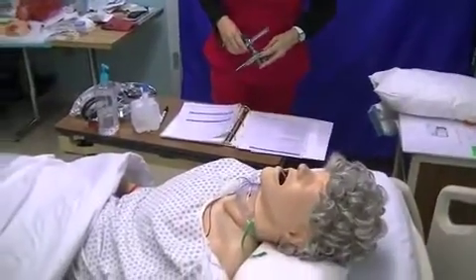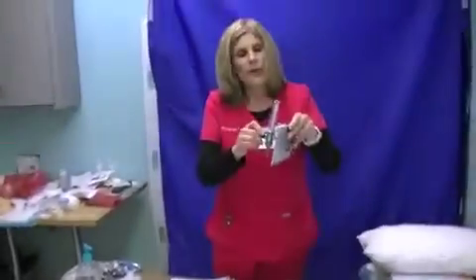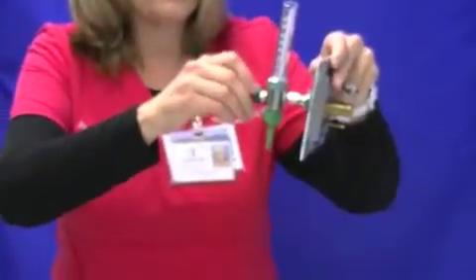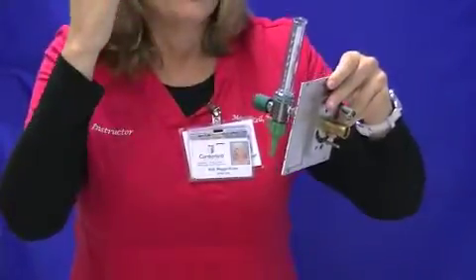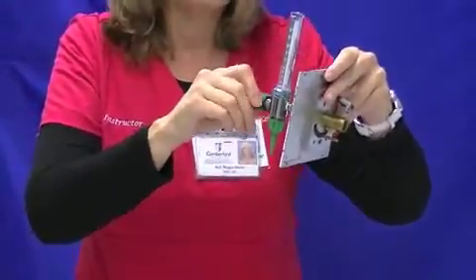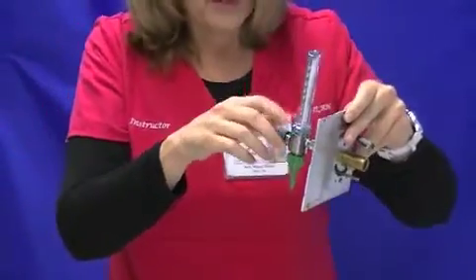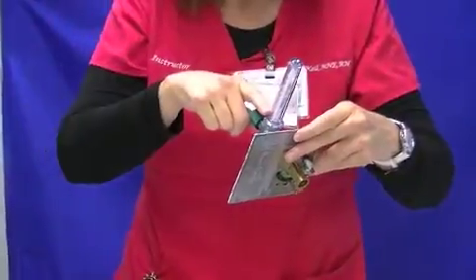or you might have some portable oxygen. And then we connect the tubing. The flow meter here regulates how much oxygen you're getting. We do that by righty-tighty, lefty-loosey. We turn the knob, and the middle of the ball needs to go right to the middle of the line, so we know exactly what liters per minute is on. These are called liters per minute, anywhere from 1 to 15 liters per minute on this.